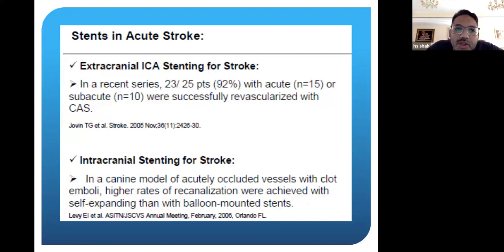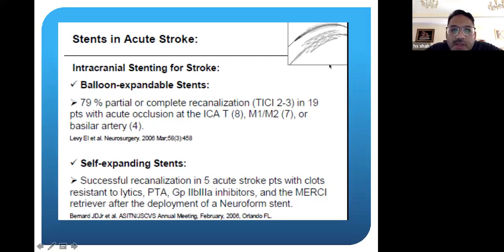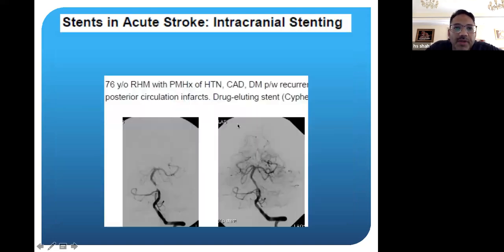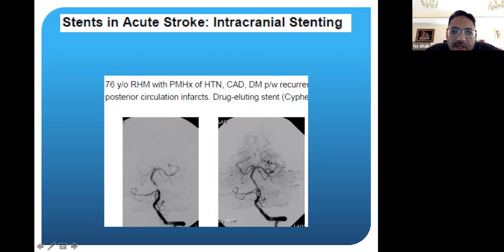Stenting also showed good results for acute stroke — if there is an acute stroke with a large clot, we will sometimes put a stent in and open the vessel. Most stents used are self-expanding stents rather than balloon-expandable, since balloon-expanding causes a little more damage to the vessel. A typical patient: 76-year-old right-handed male with hypertension, coronary artery disease, and diabetes. There's a very tight stenosis and clot in the distal circulation. Getting a balloon in, opening with a stent — in this case a drug-eluting cipher stent — once the stent is open there is flow and thrombolytic activity, eventually opening the vessel.